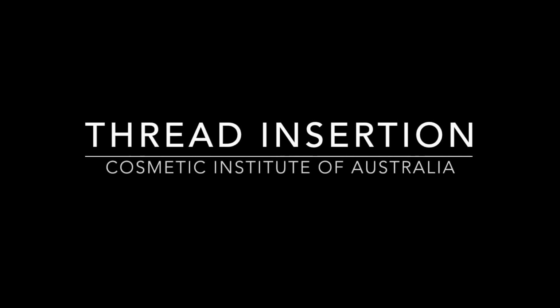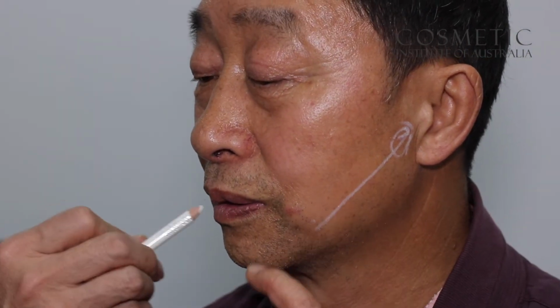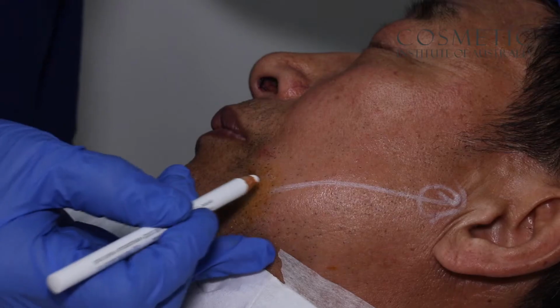In this video, we will show the recommended technique for inserting PDO threads. It is important that clinicians are familiar with the various design techniques. Through the consultation process, the patient has advised the type of lift he would like to achieve.